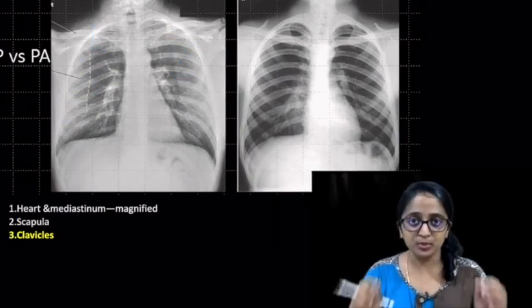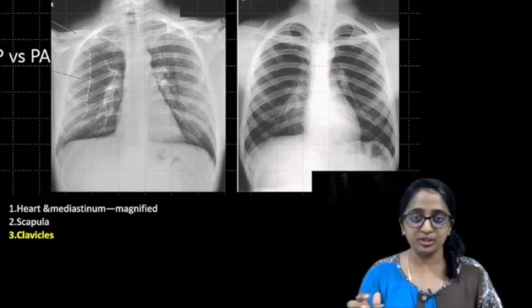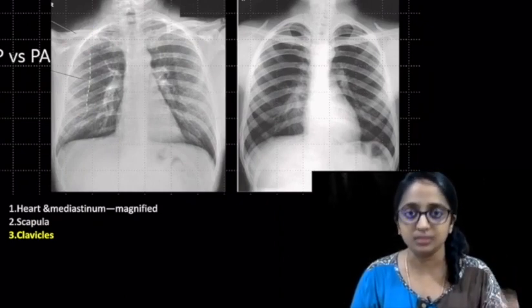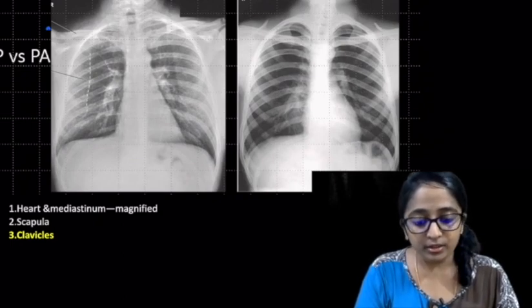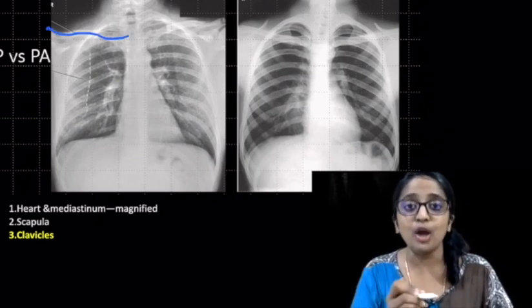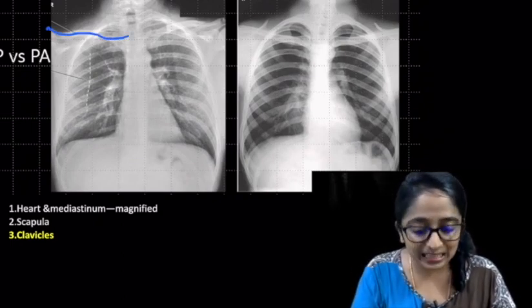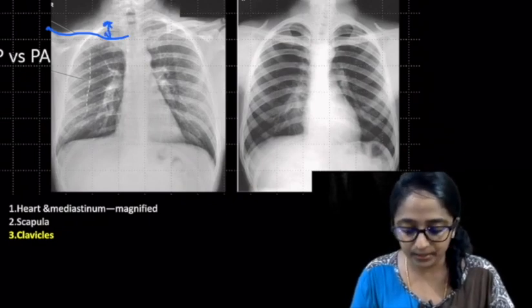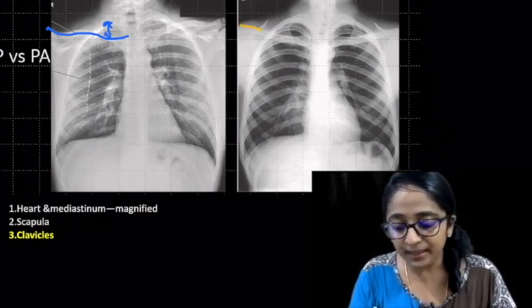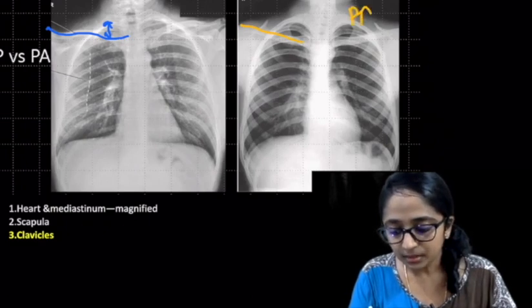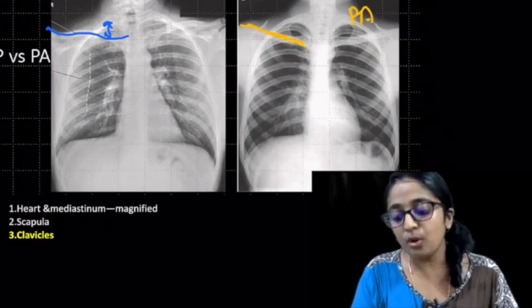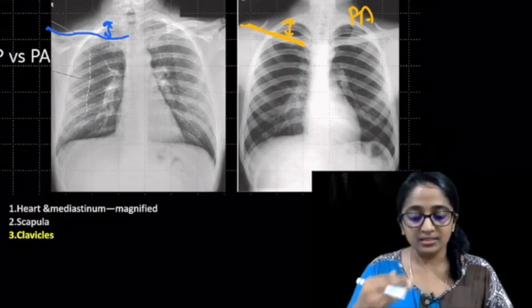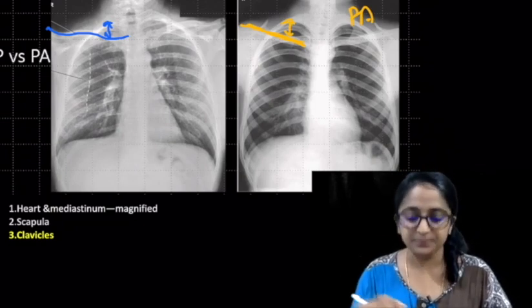The third difference between AP and PA projection can be made out by looking at the clavicles closely. In the AP radiograph, the clavicle appears to be horizontal and slightly at a higher level. In the PA view, the clavicle appears more obliquely oriented and is slightly at a lower level as compared to the AP radiograph.